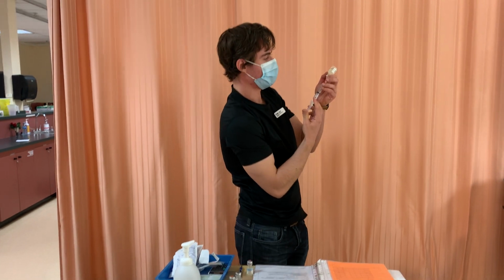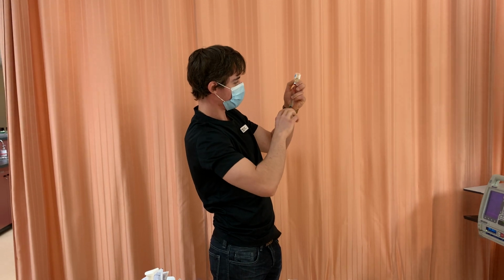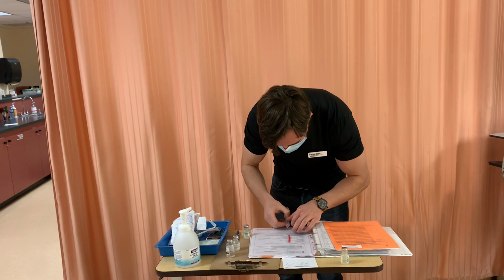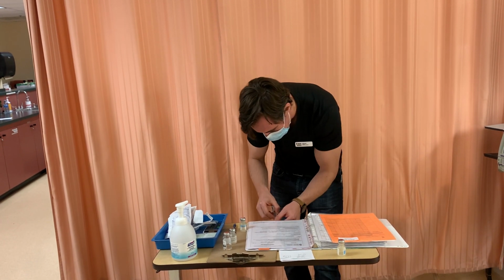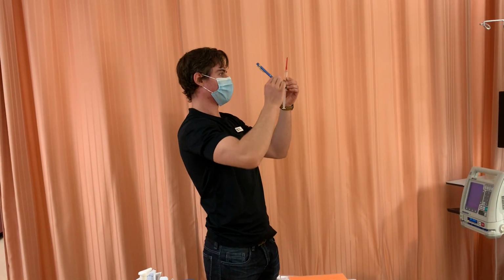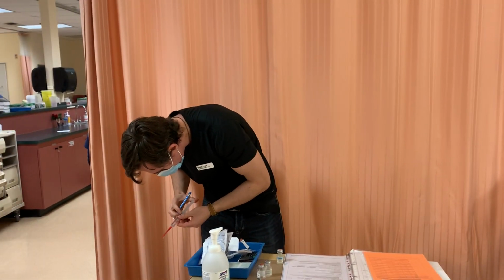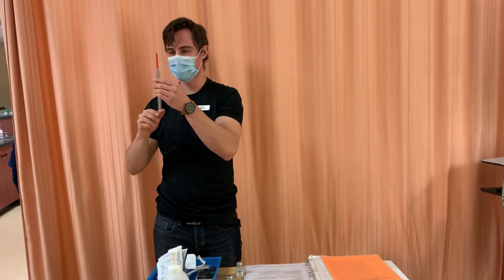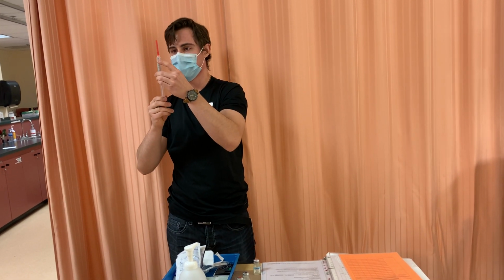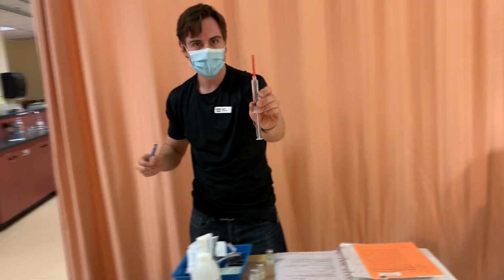Here I have 20 ml of sterile water. Now I'm going to put it in there. Pull back a little bit extra. Scoop method. I'm going to use another alcohol swab. I'll clean it for 30 seconds. Get out all the bubbles. Clean to dry. Now I'm going to instill the sterile water to mix them together. Make sure I have 10 there.